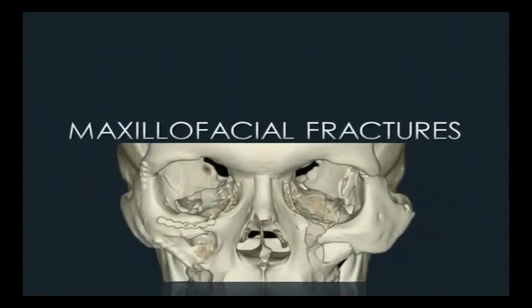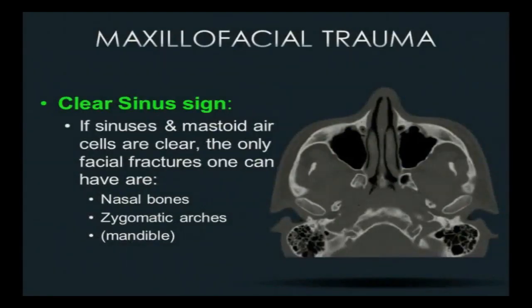One of the best take-home signs is the clear sinus sign. If your paranasal sinuses and mastoid air cells are free of fluid and clear, the only facial fractures you'd have are nasal bones and zygomatic arches — and if the mandible is included in your scan, the mandible is fair game too. Anything with a wall up against a sinus will invariably cause hemorrhage into that sinus when that wall is broken. It's a very good tool to get through volume quickly.